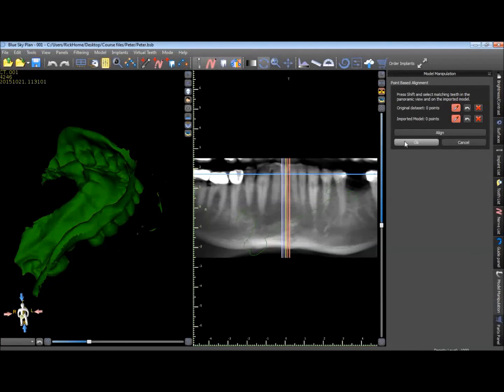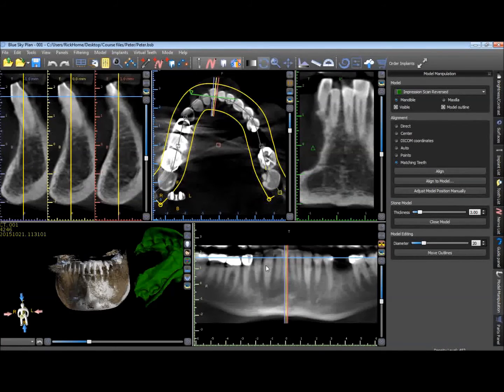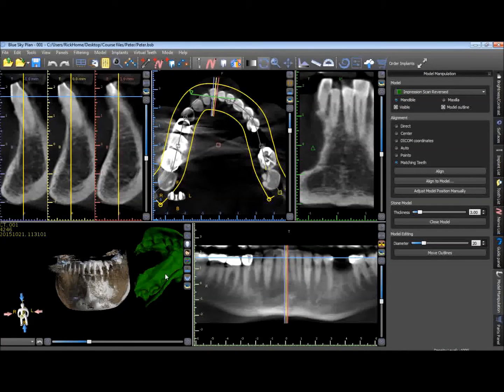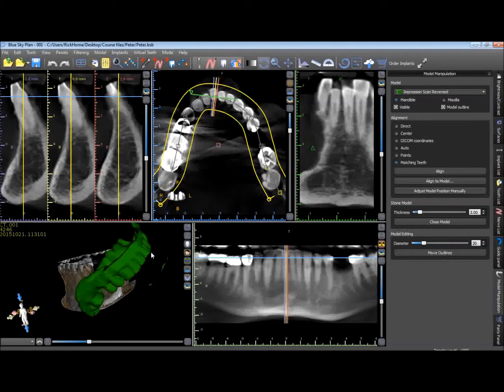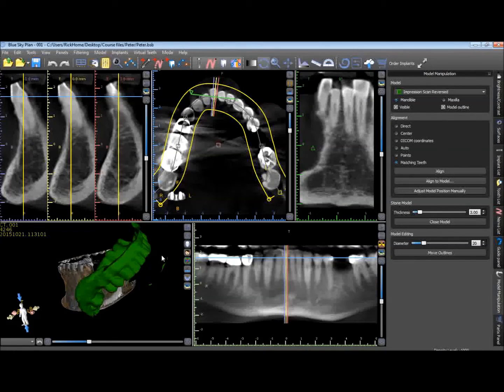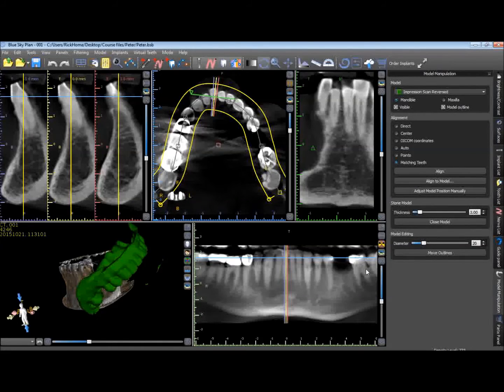And what it's going to want to do, it's going to try to align by teeth. So we're going to hit cancel. Before we align this model, what we want to do is clear up some of this extra area here that we didn't cut out.